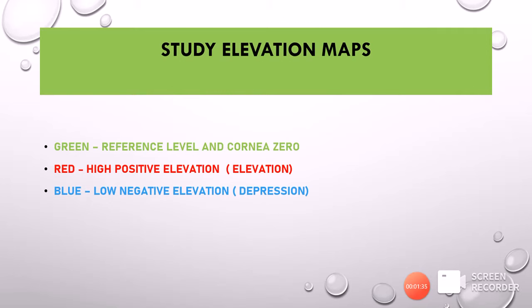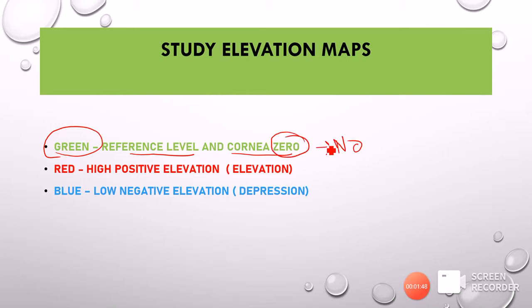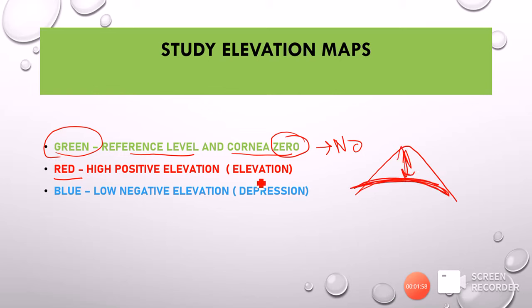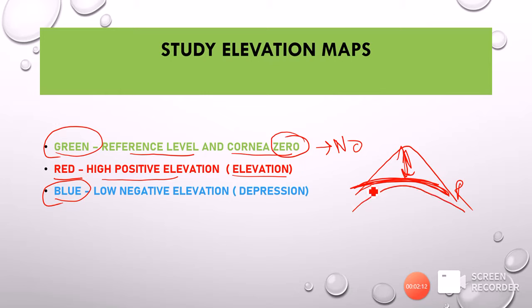In the elevation maps, as with curvature maps, they are color-coded. A green color means the reference level and corneal curvature are the same — zero difference, no risk. A red zone means the cornea is more elevated compared to the reference plane, indicating high positive elevation, which is risky — meaning the cornea is steeper than the reference plane. A blue zone means the cornea is flatter compared to the reference zone, below the reference level, called low negative elevation or depression.